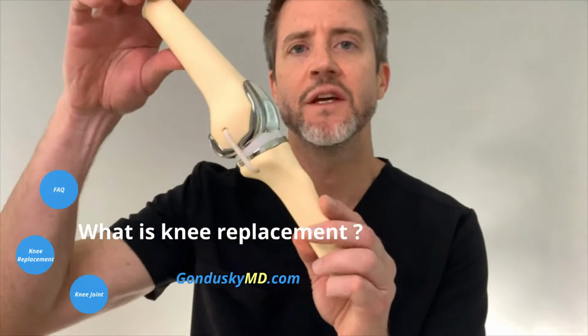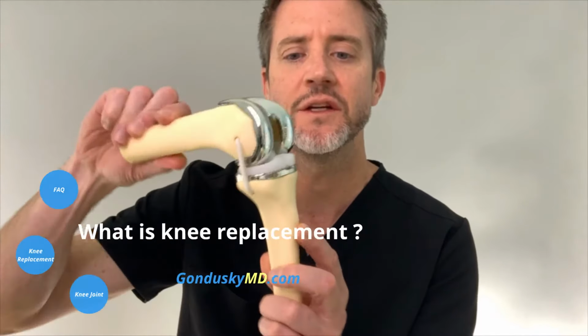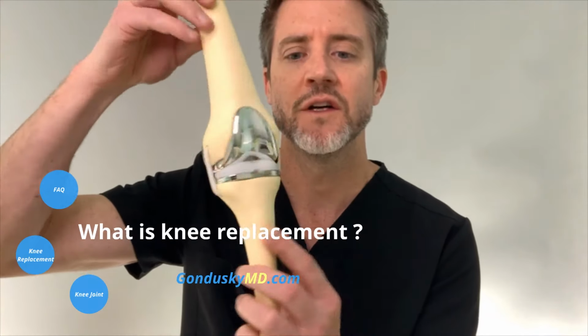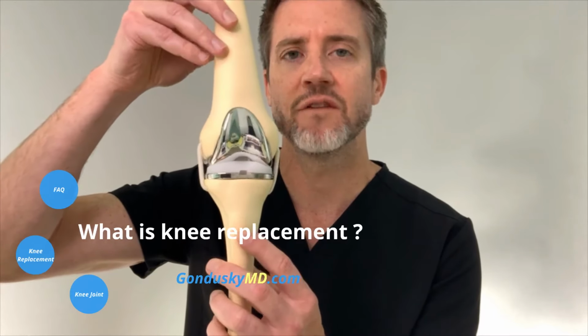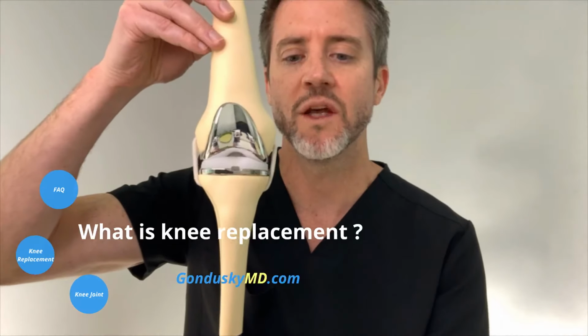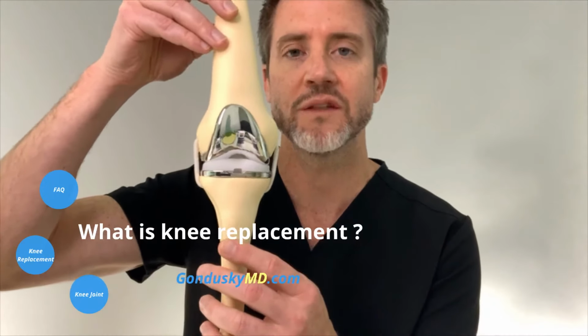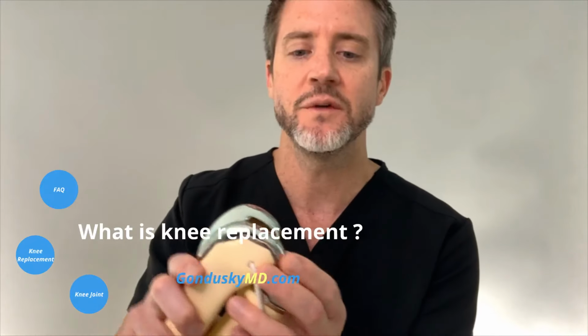So this is a knee. The knee from the side bends back and forth like a hinge. It's a hinge joint, and it bends back and forth. So this is the knee from the front. So in a replaced joint, we have replaced the ends of the bones, which have bone-on-bone contact, with replacement parts. So in a knee replacement, here is the femur.